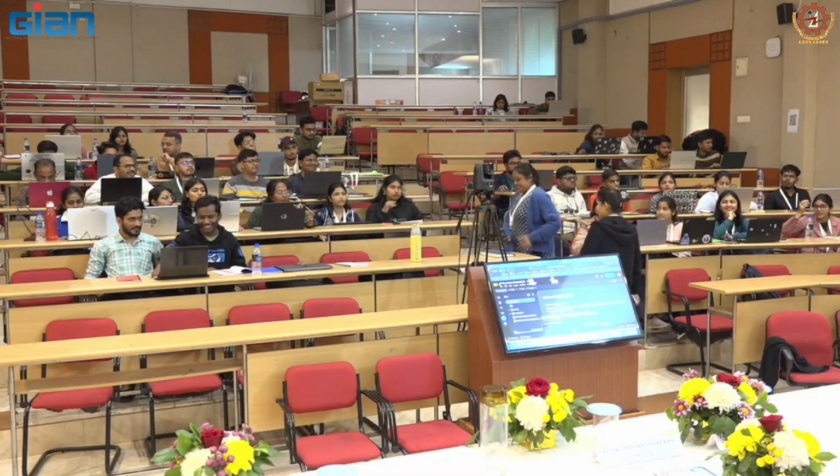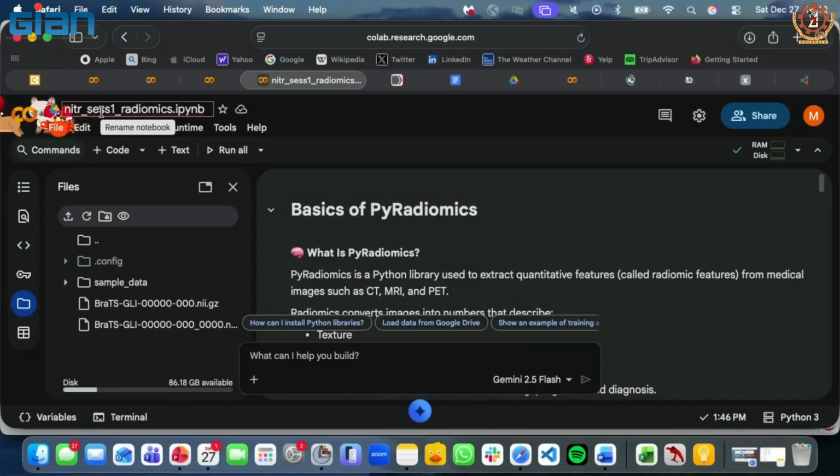I'll reiterate it once again for the guys who joined just now. In the folder, you will have another notebook named NITR session one Radiomics. So again, upload it to Google Colab, and upload.